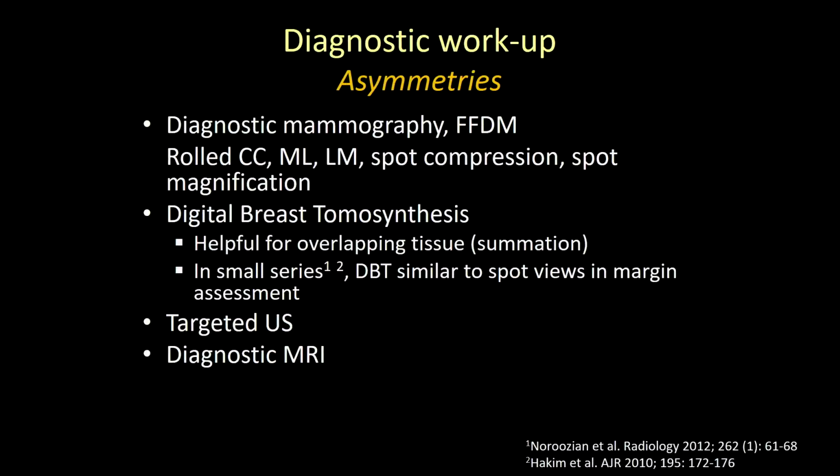And then I'd like to spend the last couple of minutes talking about targeted ultrasound, which we use really all the time in the diagnostic world, and the role of diagnostic MRI in evaluating asymmetries, which is a limited but sometimes very helpful one.